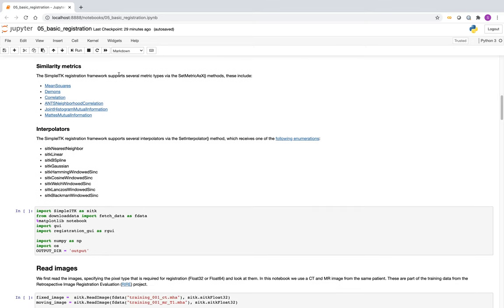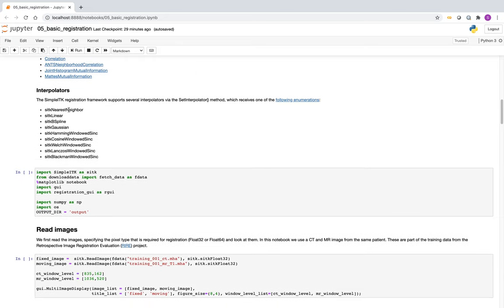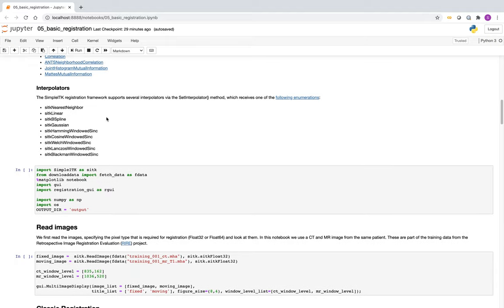Similarity metrics are the ways we compare our images. We have mean squares, demons, correlation if there's a linear relationship, neighborhood correlation — essentially looking at the correlation in regions — and mutual information in two variants. SimpleITK supports a large number of interpolators, but we will stick with linear, which is a compromise between performance and behavior. If we work with label images, we use nearest neighbor because we don't want to introduce information that isn't originally there.